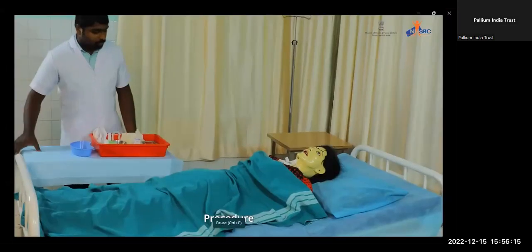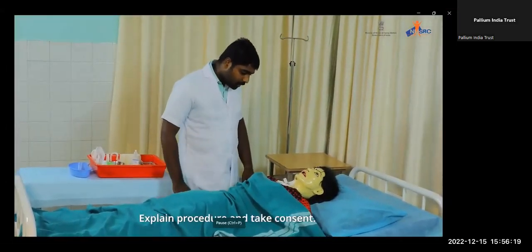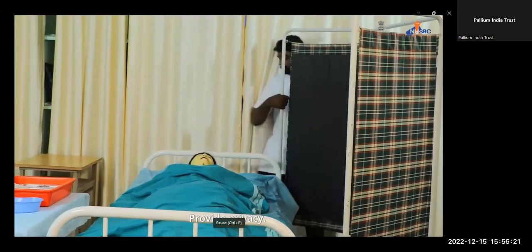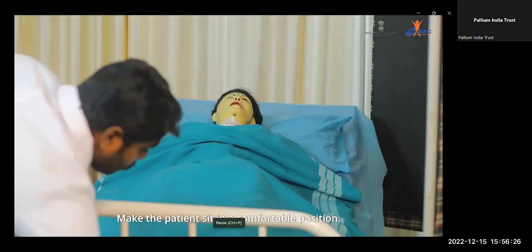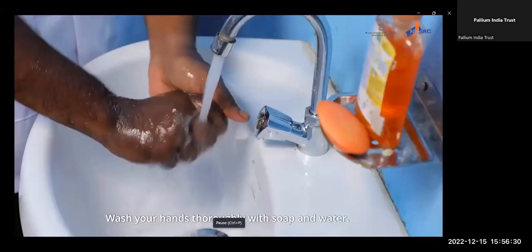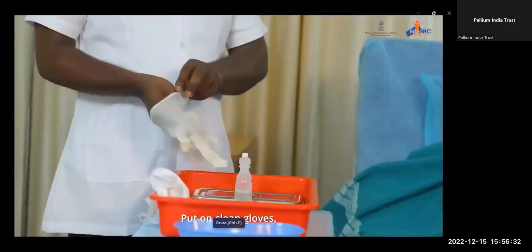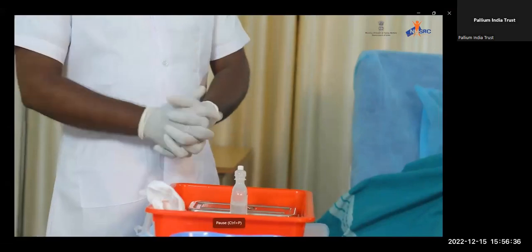Procedure: greet the patient, explain the procedure and take consent. Provide privacy. Make the patient sit in a comfortable position. Wash your hands thoroughly with soap and water. Put on clean gloves.